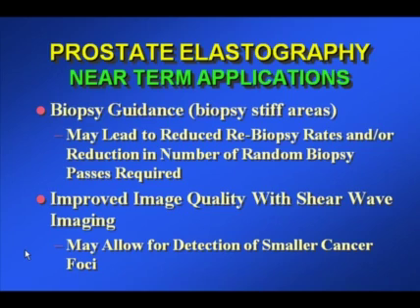So, near-term applications for prostate elastography. The main one is biopsy guidance. If you see a stiff area on an elastogram and you're planning to biopsy anyway, then it would make sense to biopsy that stiff area and make sure that you get a few extra cores in that region to confirm that there's not a cancer lurking in that area.